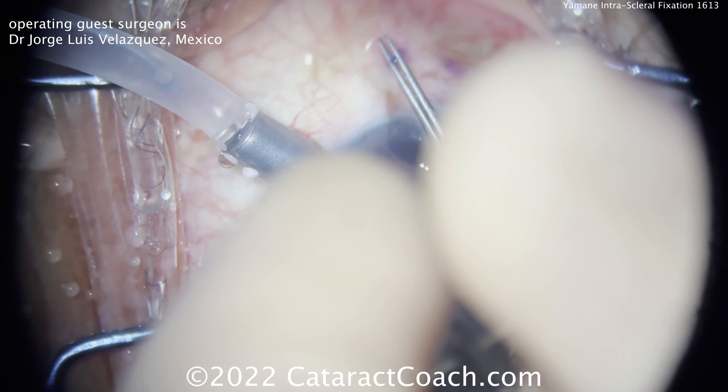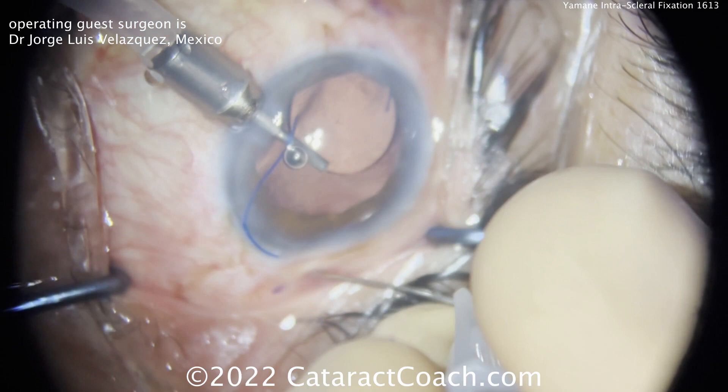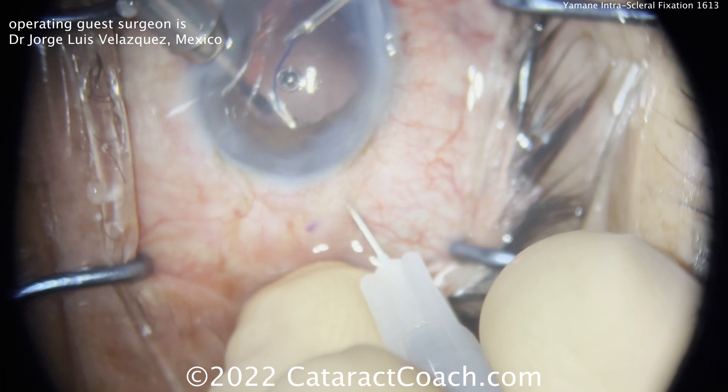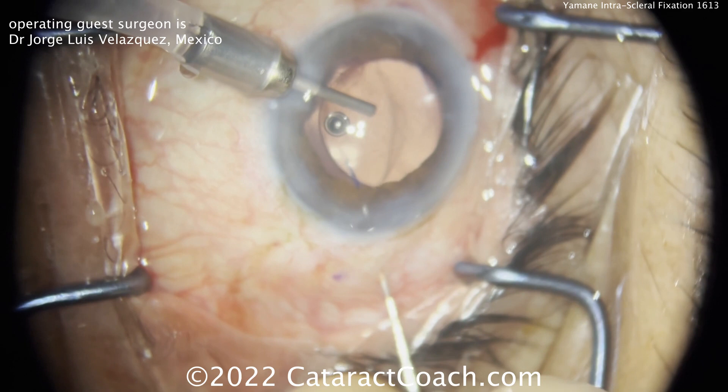Using that AC maintainer helps support the optic and bring it up. Now there's the first haptic being pulled outside the conjunctiva and sclera, with a little cautery done to create a bulbous tip. On the opposite side, this is the 30-gauge STK thin-walled needle — make sure you have an appropriate tunnel length in the sclera. The forceps bring that last haptic back inside the eye, pushing it through the hollow lumen of the 30-gauge needle and out of the eye. That looks great.